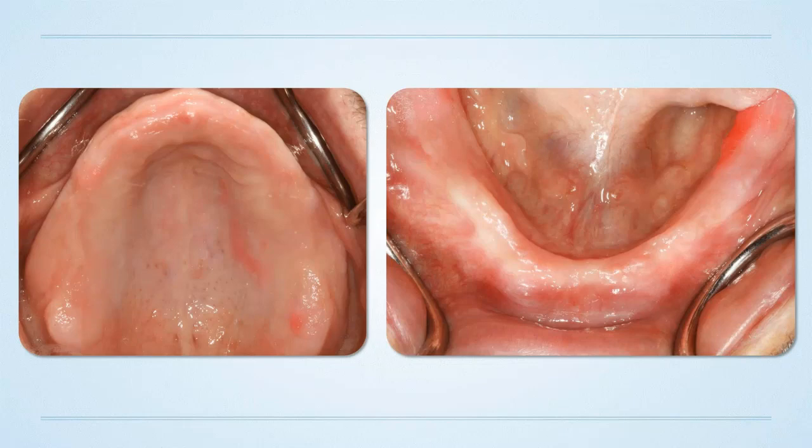What's interesting in this clinical presentation, however, is you can see here on the screen, we're trained in dental school to look at arches, look at keratinized tissue, look at our bone conformation. Is this patient a good candidate for implant overdenture treatment or for any sort of implant treatment? Well, clearly this is a patient missing all of their teeth. And a patient that is missing all of their teeth, in my eyes and in my book, is always a candidate for some sort of implant treatment to improve their quality of life.